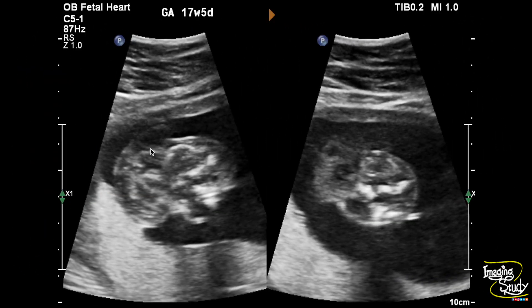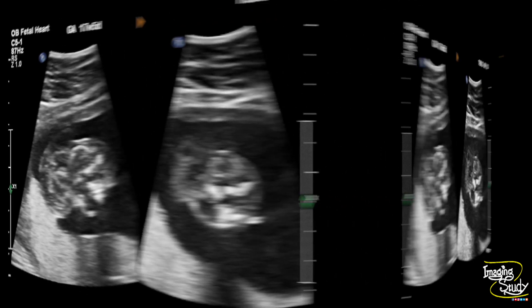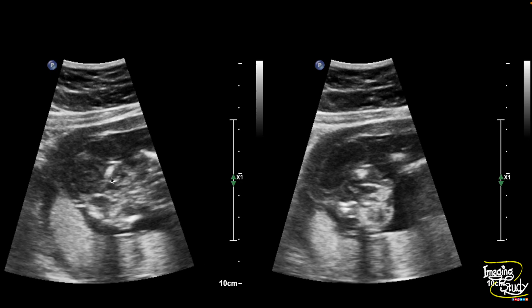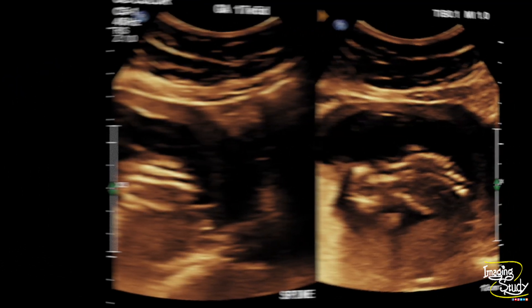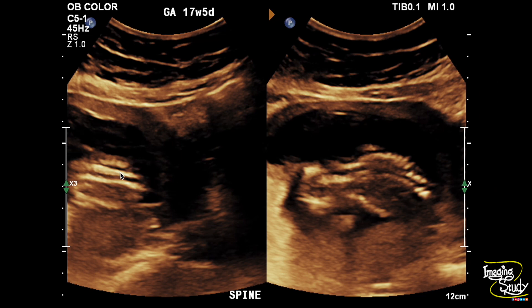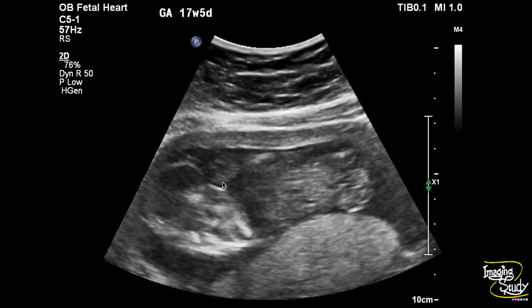Again another picture and you can see the brain matter is herniating outside. Another picture of the encephalocele. This is the picture of the spine which looks quite normal. Here again another picture and you can see this encephalocele.